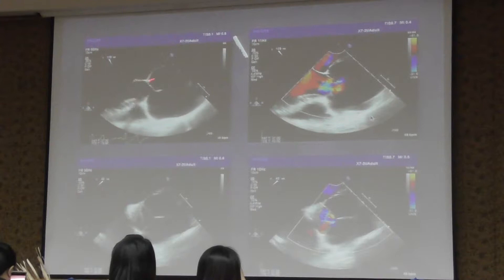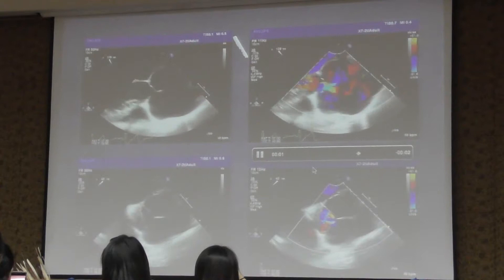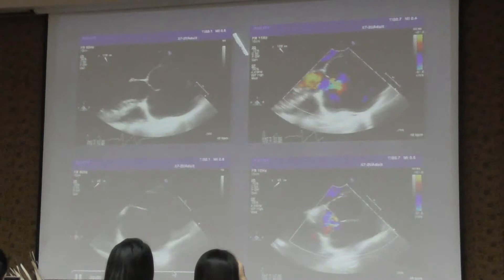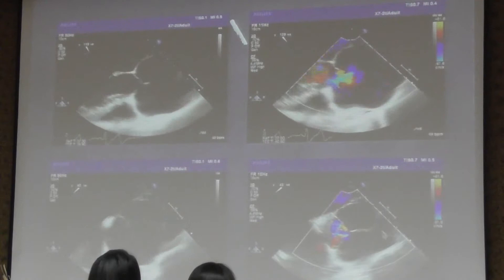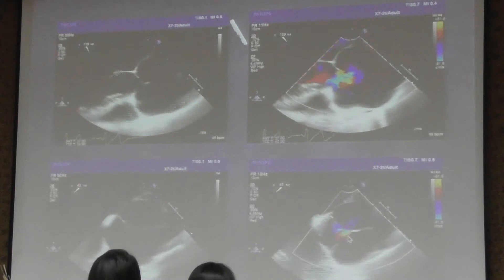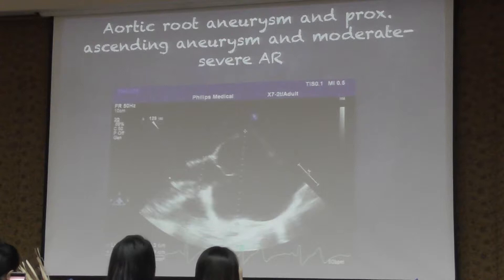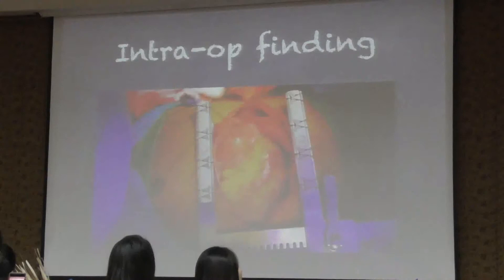This is the view on echo. Here you can see the large sinuses of Valsalva — the graft and the root have a small annulus. This is the color flow, showing the regurgitation of the sinuses of Valsalva. The leaflets still look thin with no calcification. You can see the regurgitation. The central regurgitation jet is at the center. The aortic annulus is about 23 mm, and the sinuses of Valsalva are about 6.9 cm — that's big.